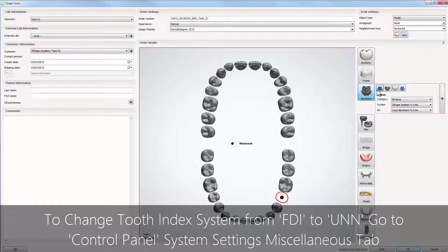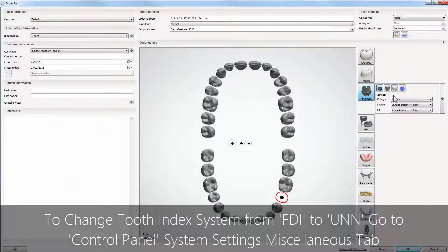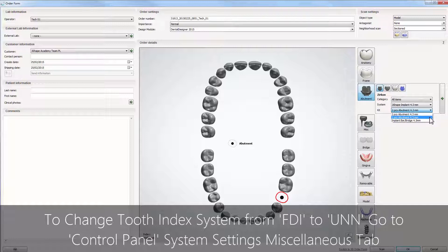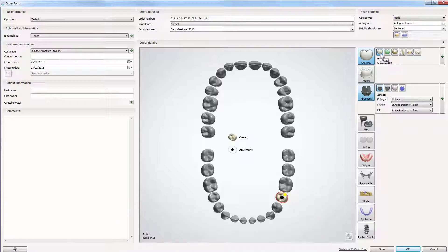A customized abutment is one of four types of abutments supported by the 3Shape dental system. Please select if you are going to manufacture a one-piece or two-piece abutment. This type of restoration requires a coping or a crown designed on top to fulfill the aesthetic requirements.